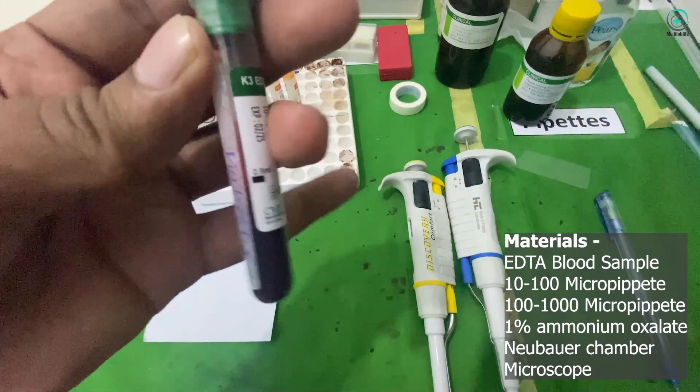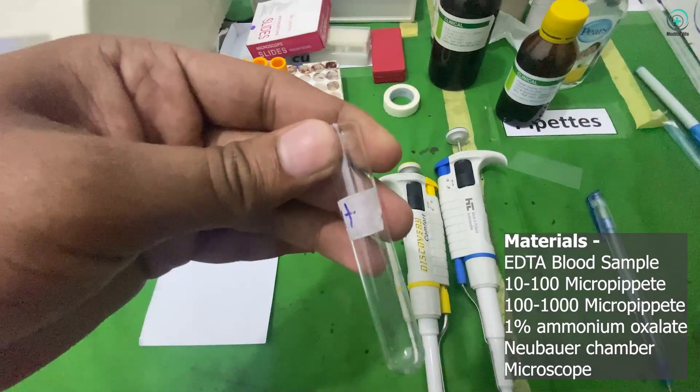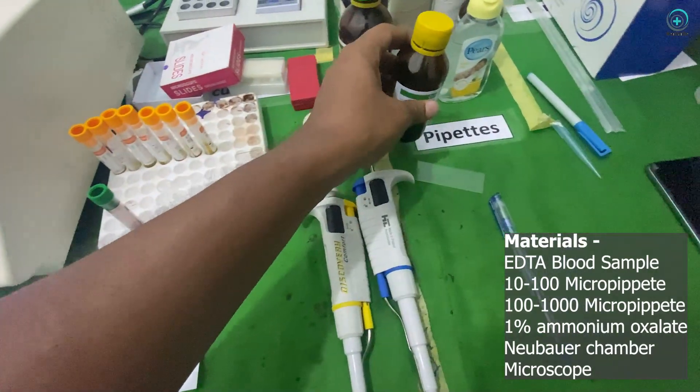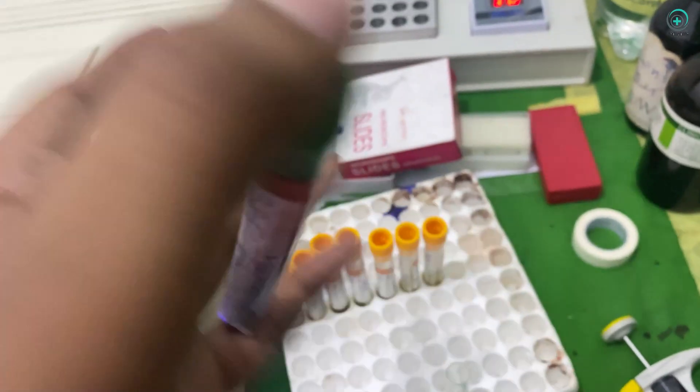First, you'll need a blood sample collected in an EDTA tube. Then, label the tube and gently invert it to ensure proper mixing.